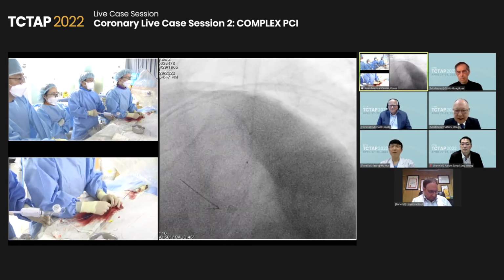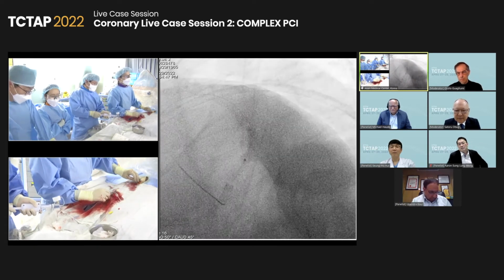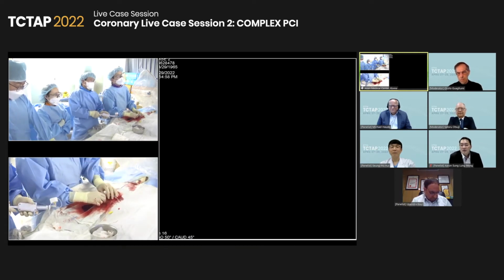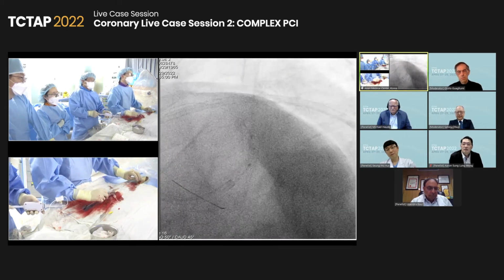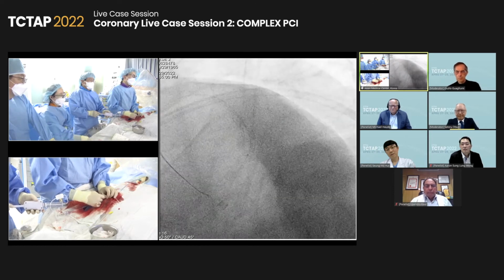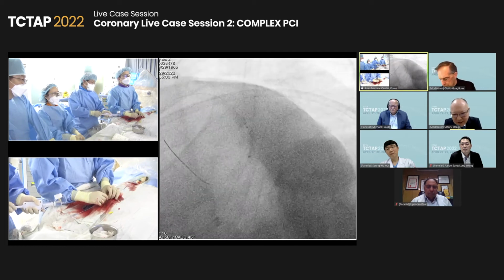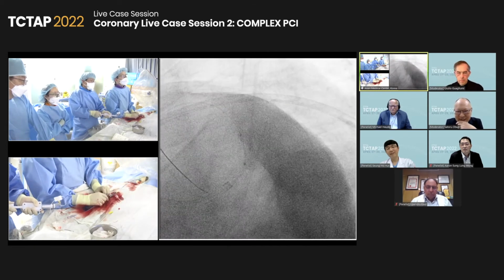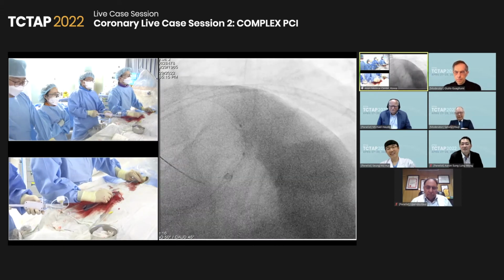So I think we evaluated the population and the size of the vessel, and it was more about 4.0. So if we use 3.5 and see, then that would not be so dangerous. It only dilates the healthy part. Yeah, right. Kenny, be careful. Deflation. Okay, I'll take care.